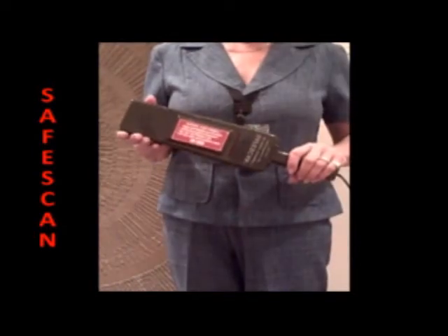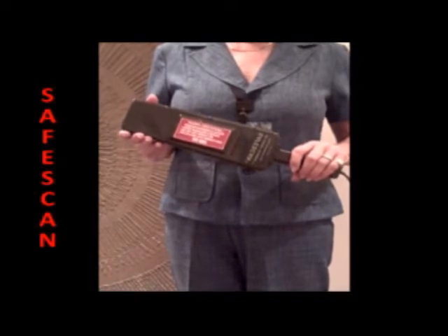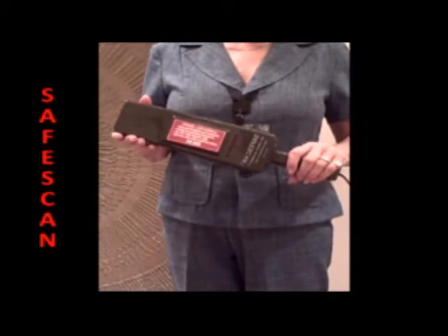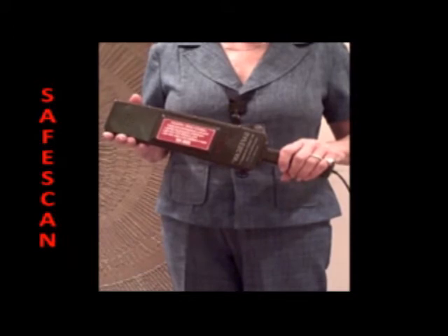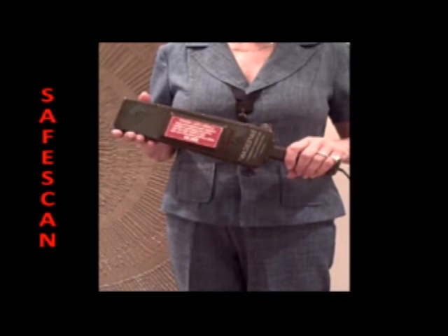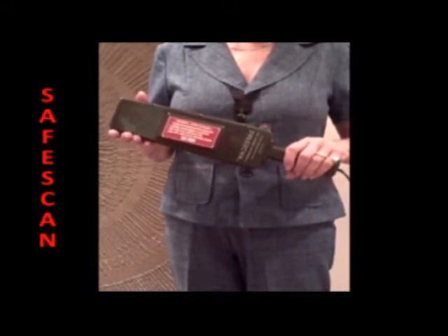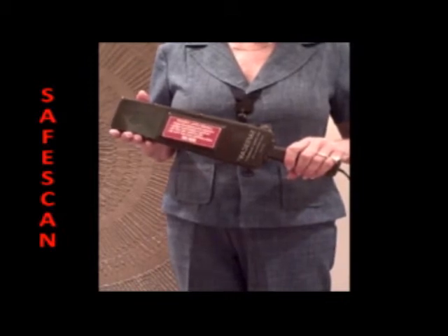The target scanner is intended for screening patients and staff members for objects being carried into the MRI suite, thus intercepting them before they can wreak havoc in the MRI environment. The target scanner is used after the patient has been medically cleared to enter the huge field of the MRI. The target scanner is not a substitute for conscientious medical screening. You do your standard medical screening protocol, then use the target scanner as a second line of defense.